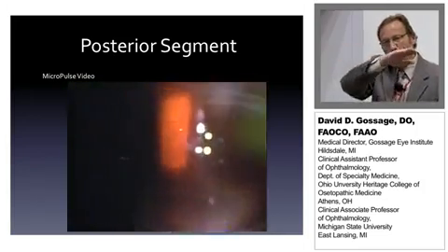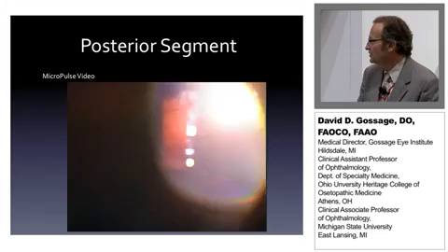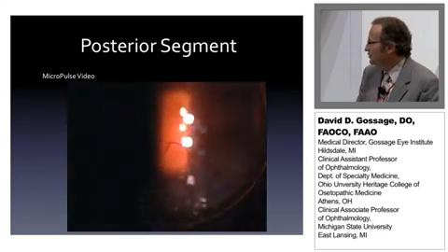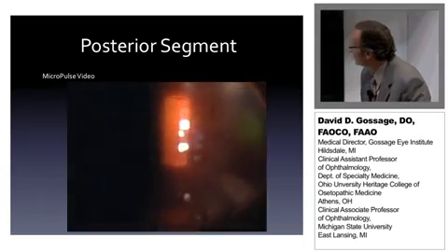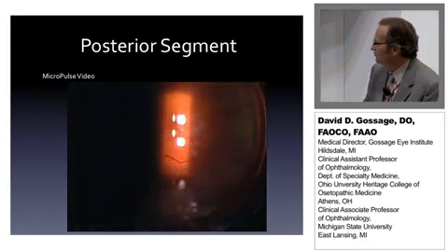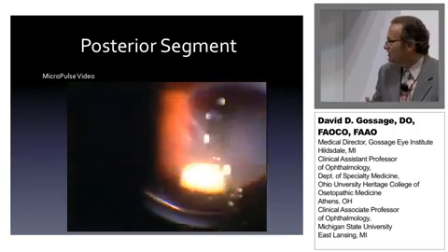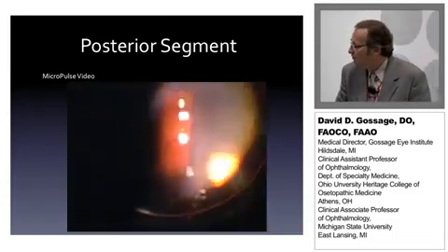I'll work my way horizontally and then vertically, going over the area multiple times. This was a patient with diabetic macular edema, and you can see they've had some previous laser work too. Once again, I apologize for not the clearest of videos, but I just tried to throw one in there to show you what it looks like.